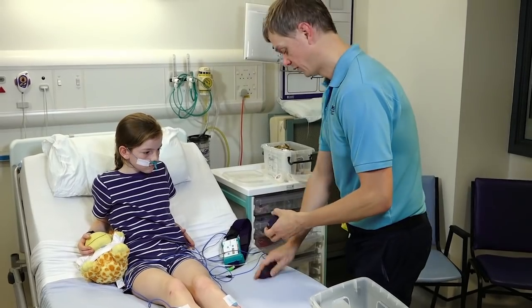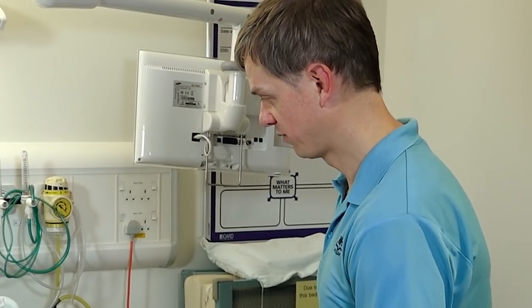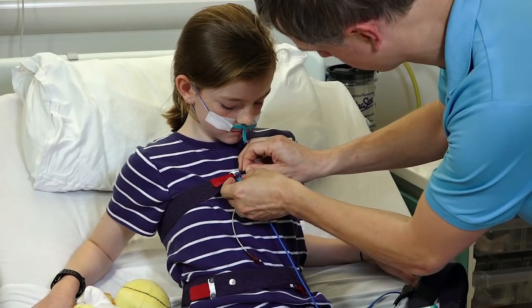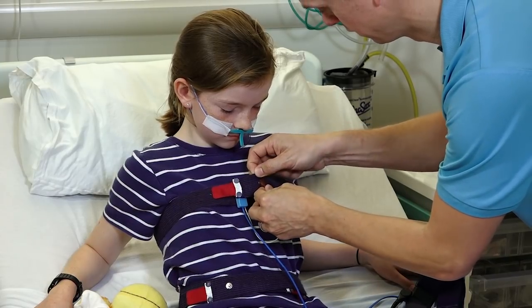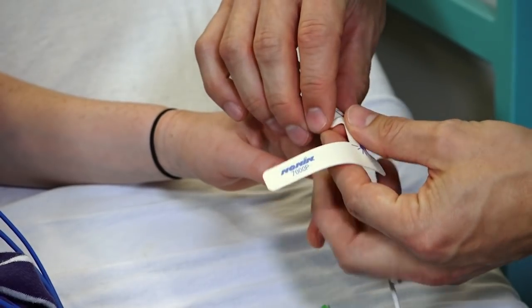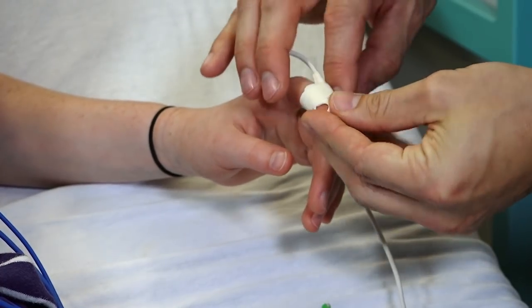These two bands are going to go around you — one round your chest and one round your tummy. So when you breathe, these bands are going to move back and forward. This one is the oxygen probe — it has a little red light that goes on your finger. It tells us what your oxygen levels do during the night, because they can change if your breathing changes as well.